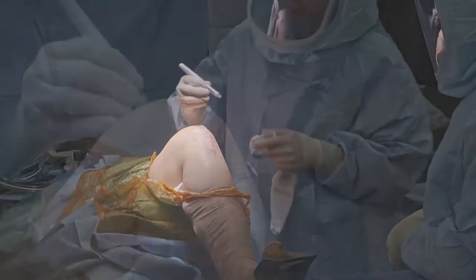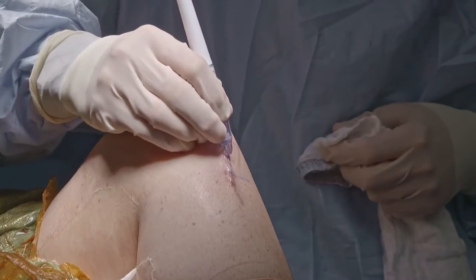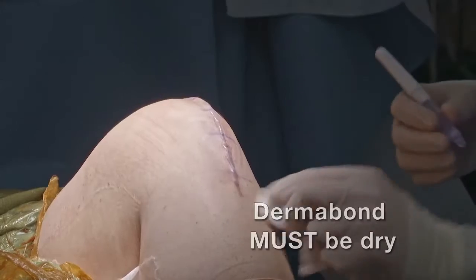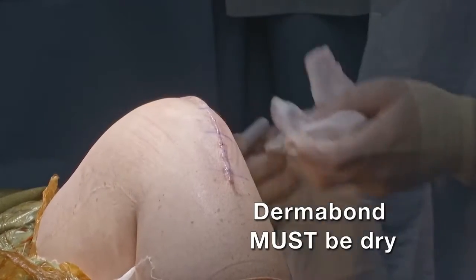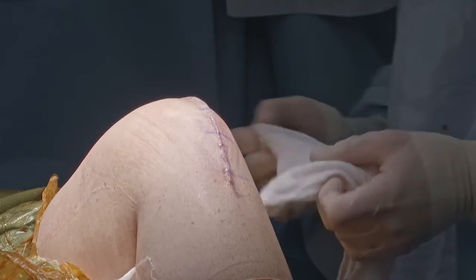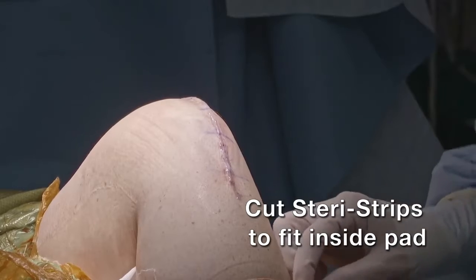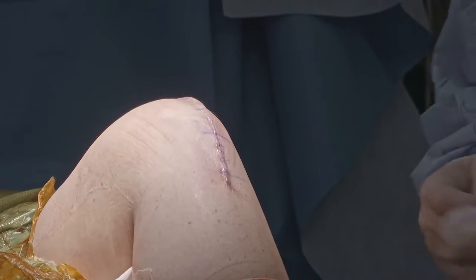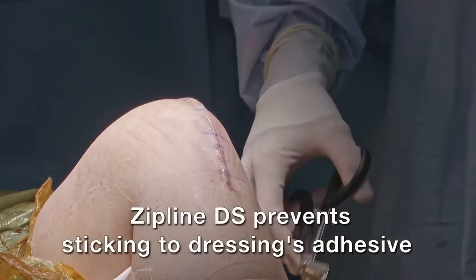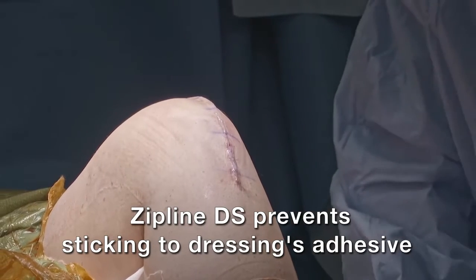We use a skin glue to seal the wound and help minimize drainage. It is important to allow sufficient time for the glue to dry so as not to stick to the dressing pad. If you choose to use Steri-Strips, cut the strips to fit the inside of the hydrofiber pad. If you use a Zip-line closure, there is a dressing shield called a Zip-line DS, which prevents the Zip-line from sticking to the adhesive border of the dressing.